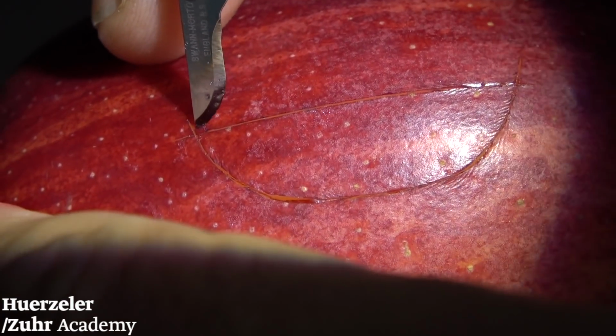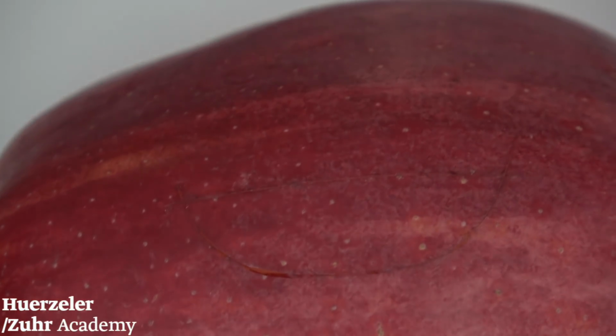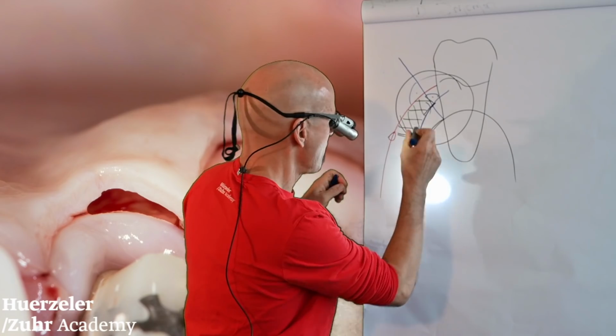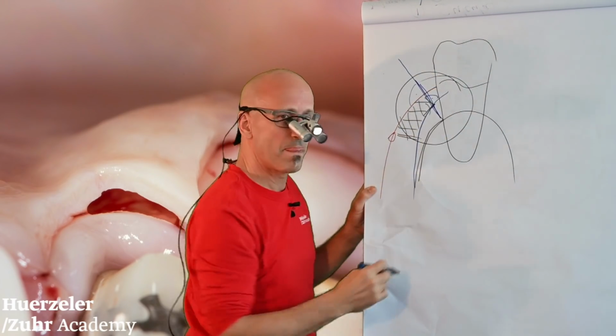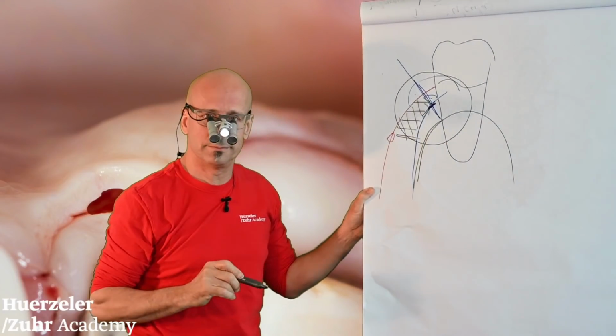Now in the tissue, let me share this with you briefly. When we go back to the patient, when we prepare a split thickness flap, I wait, okay? So, you see, we have done this cut now. And now we need to go at this point to go in there.